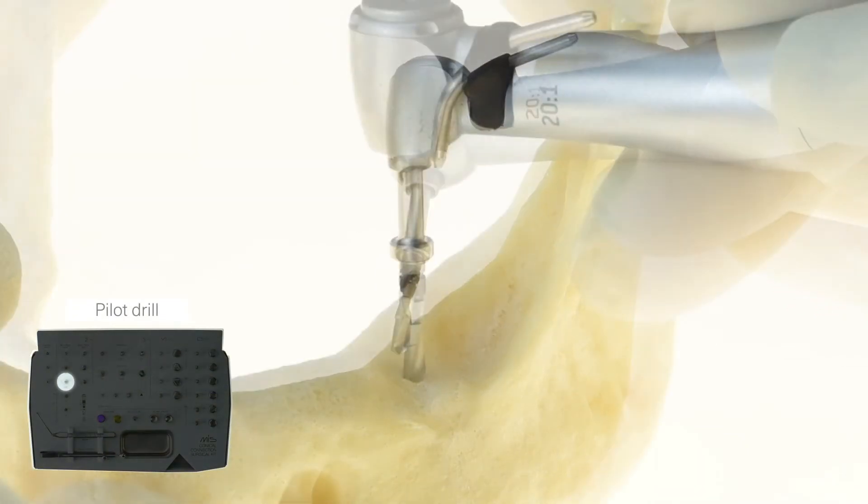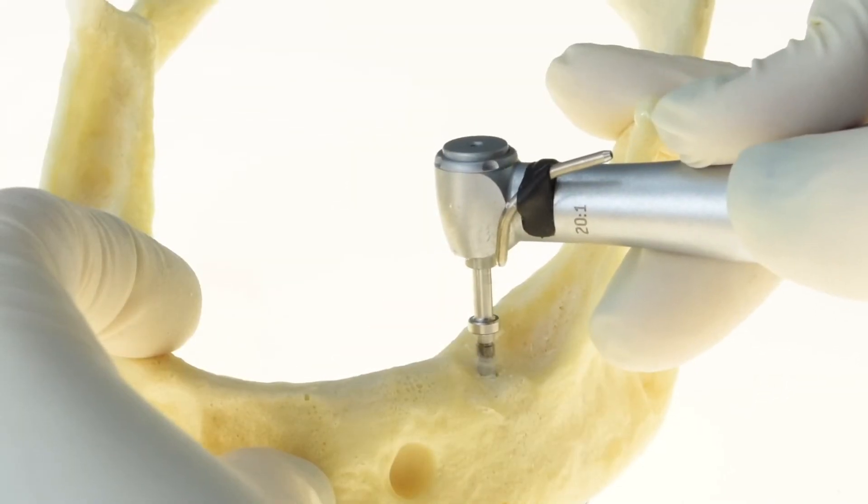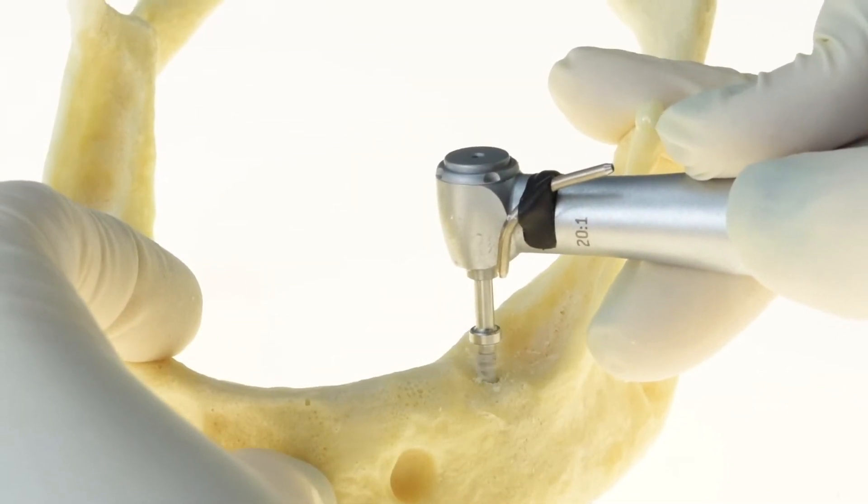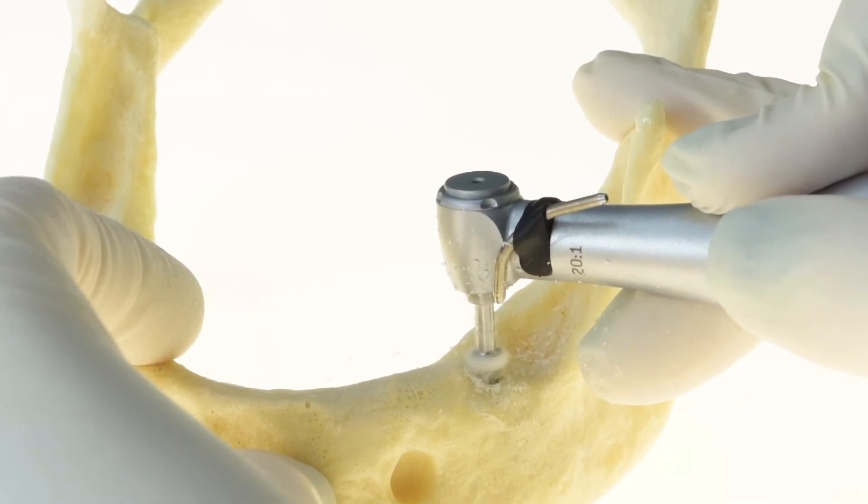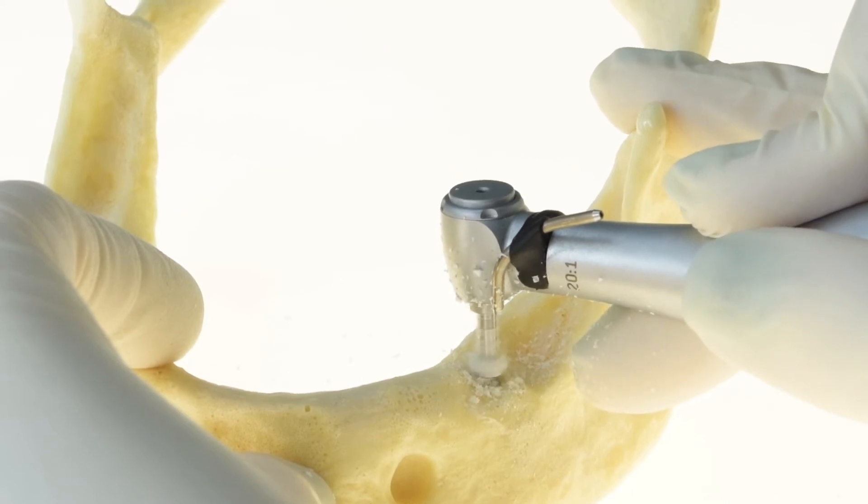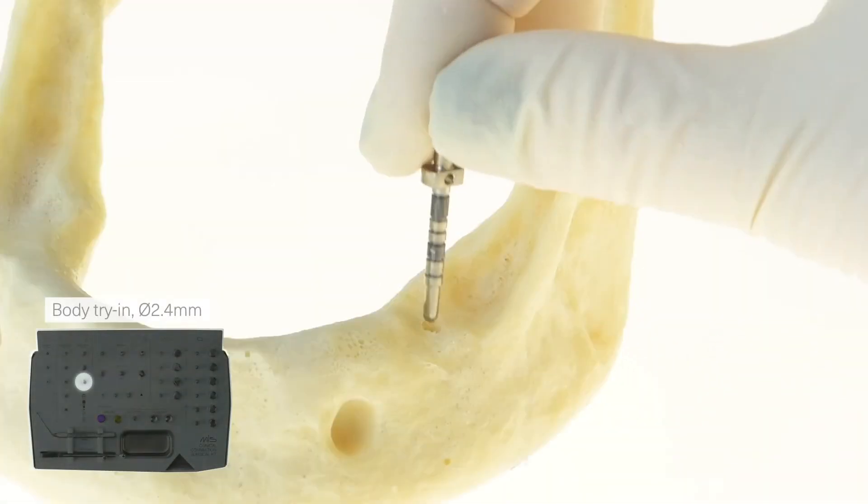The pilot drill includes a built-in stopper, where the drill tip is 2 mm in diameter, while the rest of the drill is 2.4. This step ensures a more stable start to the procedure. The pilot drill goes to the full depth of the osteotomy.